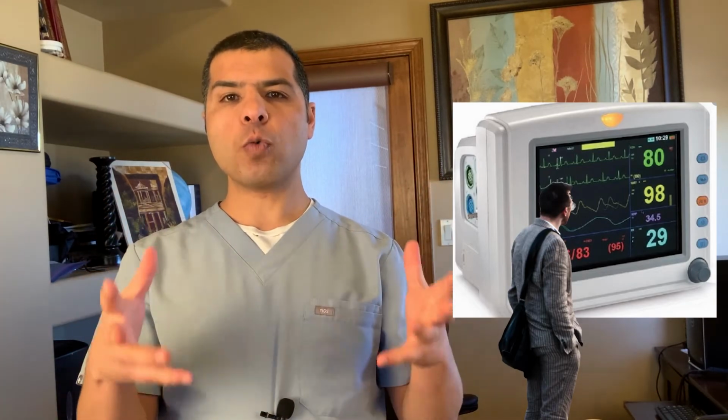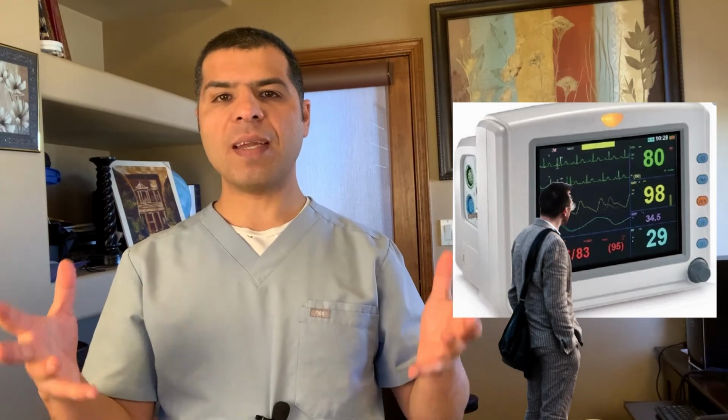Usually, if I try twice and I cannot find the vocal cord and insert the ET tube, I tell them to call the backup right away. There is really no need to keep trying if somebody else with more experience is available. Just call them and let them help you with that. Usually, who are those people? Anesthesia, an ER physician, or a colleague who is more experienced in endotracheal intubation.